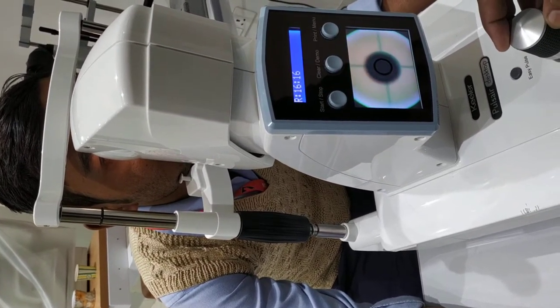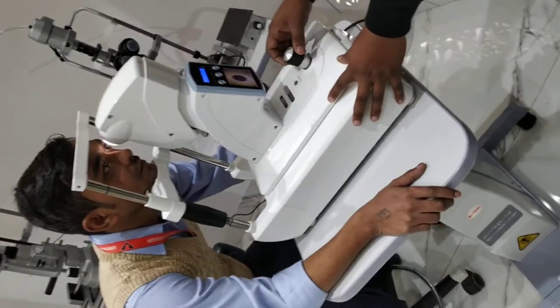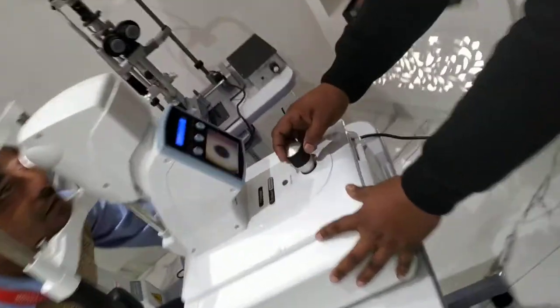Within seconds you will get the data. Now we have to move right to left — right to left, automatically.